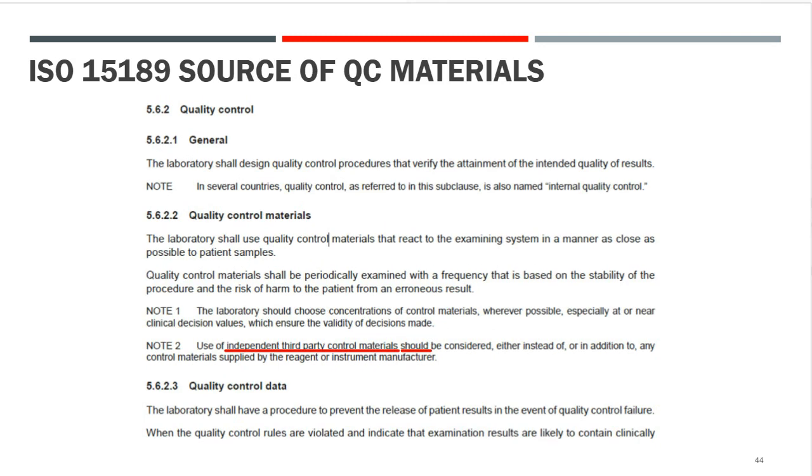Again, independent third-party controls should be considered. Do you have to? No. It's a really good idea when it says should. Independent third-party controls help, and they say either instead of or in addition to any control material supplied by the reagent or instrument manufacturer. There's a lot to be said in favor of third-party controls.